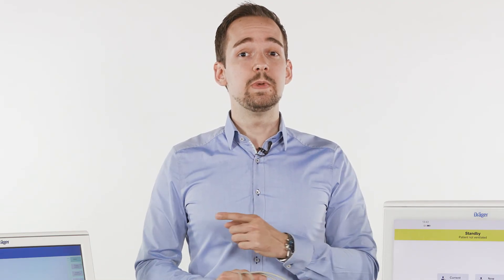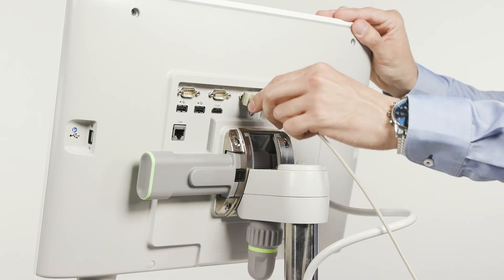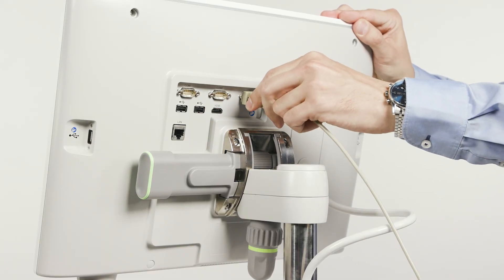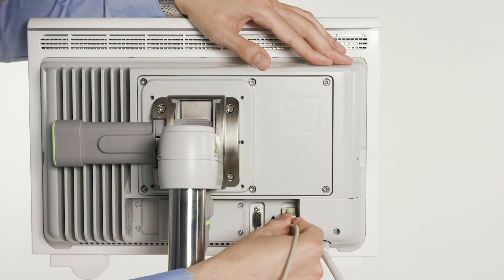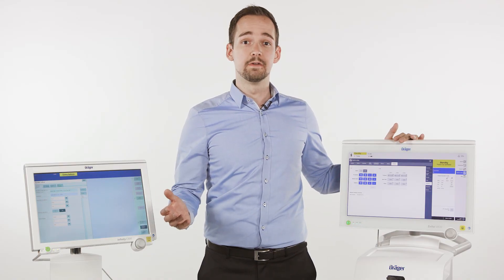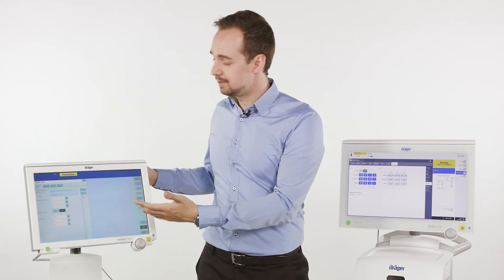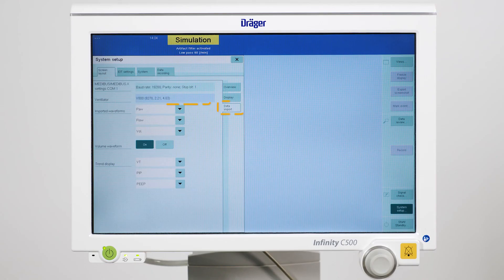First we need to establish a connection between the Evita and POMOVISTA. All we need is a Medibus cable which is connected to the COM ports of both devices to transfer ventilation data. After setting the Medibus preferences of the ventilator to the following settings, the connected ventilator will be displayed in the data import window of POMOVISTA together with the imported ventilation data.